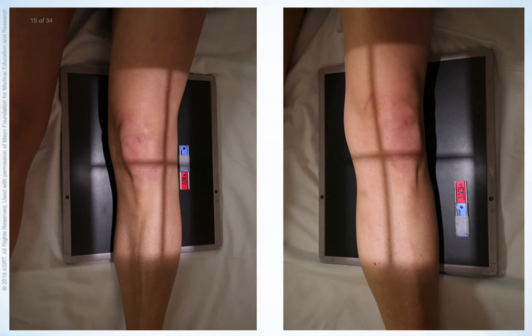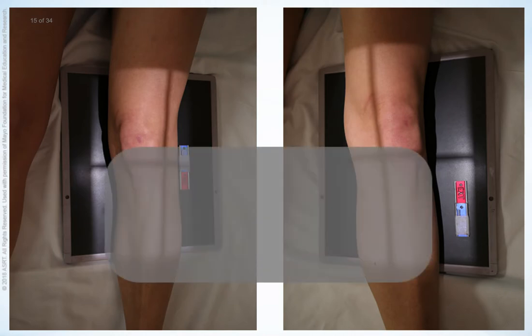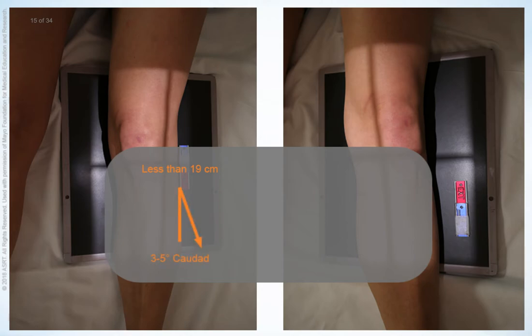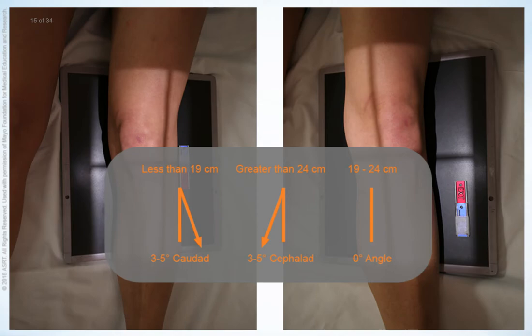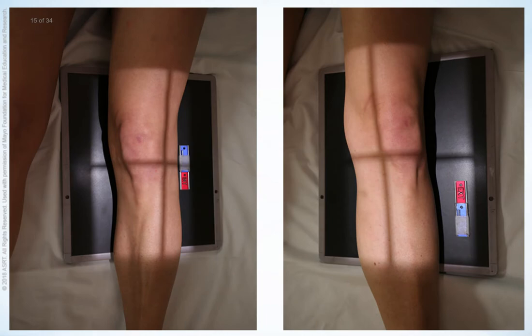As for the AP projection, the proper central ray angle is dependent on the thickness of the patient's pelvis. When the pelvis measures less than 19 cm, the central ray is angled 3 to 5 degrees caudad. When the pelvis measures greater than 24 cm, the central ray is angled 3 to 5 degrees cephalad. No angle is used when the pelvis measures between 19 and 24 cm. Anatomical markers are placed on the image receptor to identify the anatomical side being examined. The patient's gonads are shielded and the shield is placed between the x-ray source and the patient. Instruct the patient to hold very still, but no breathing instructions are necessary.